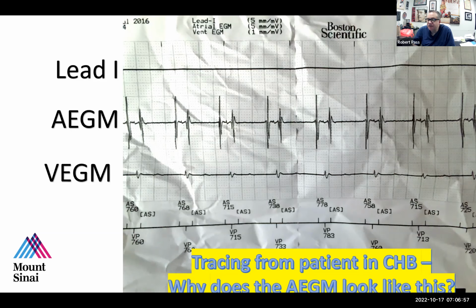So it's not uncommon, if you're deep in the right atrial appendage, and if the appendage is a longish appendage, that you will have a pretty big far field ventricular electrogram. So that's what we're seeing here. What's unusual in this tracing is that the ventricular electrogram is nearly the same size as the atrial electrogram, which gives you some insight into how deep into the appendage this lead likely was, and also how large this appendage was and how it hangs over the right ventricle. So just an interesting observation that we see somewhat regularly when we put in catheters there.